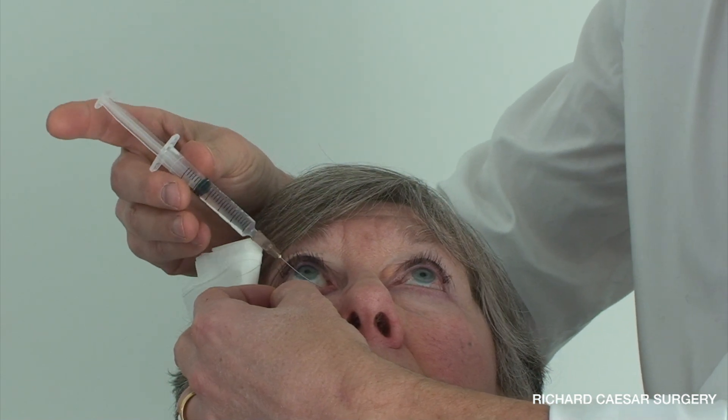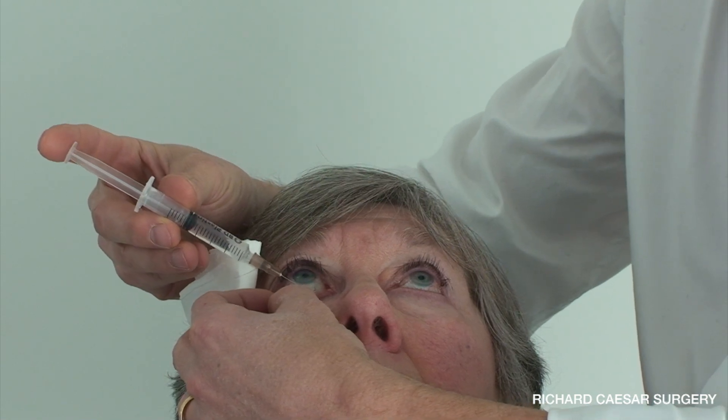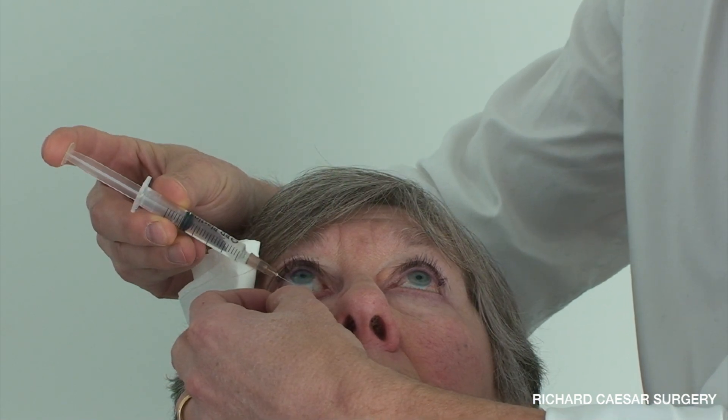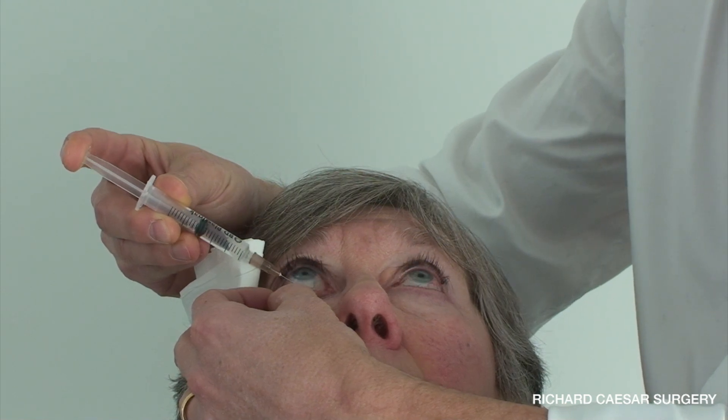The lacrimal cannula drops into the punctum vertically, and for the patient's right eye you rotate around the ampulla and depress the plunger using your forefinger.